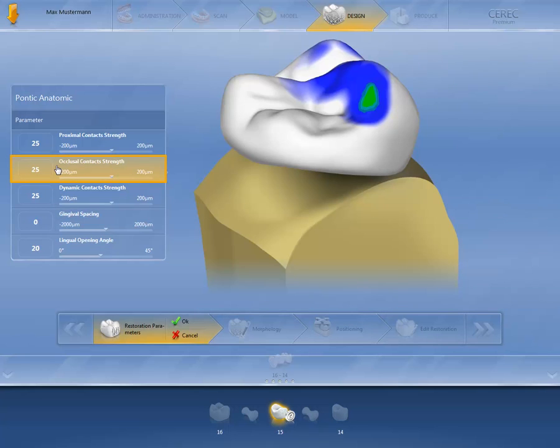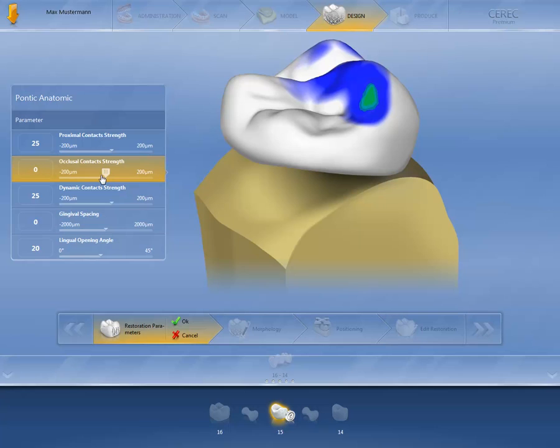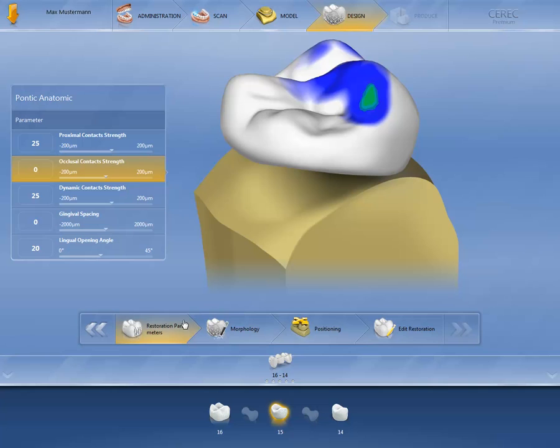Occlusal contact points can be easily identified by the colored markings, and the strength can be adapted accordingly. Confirm your changes by pressing OK. The changes were saved.